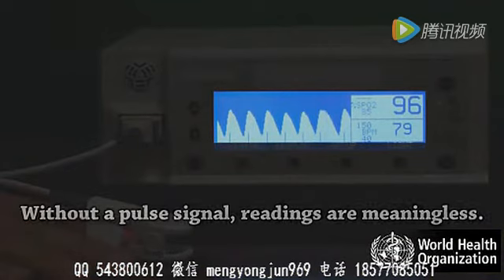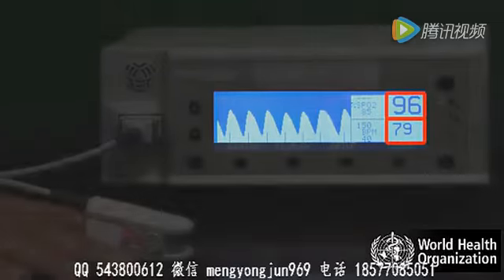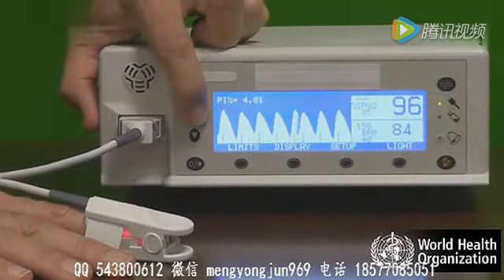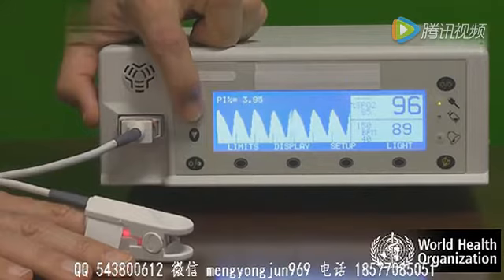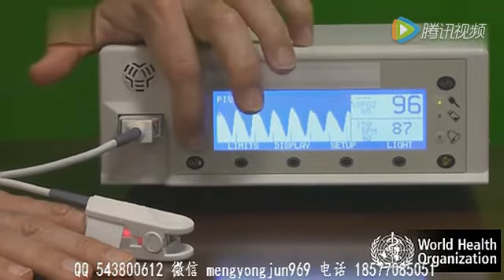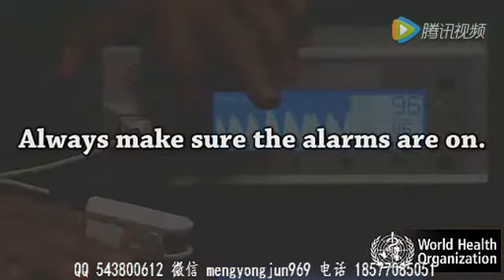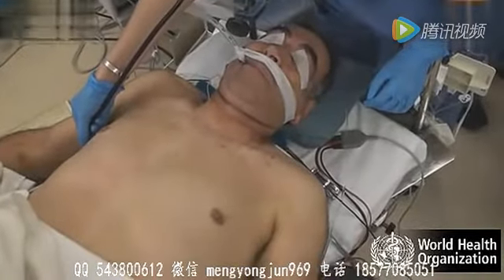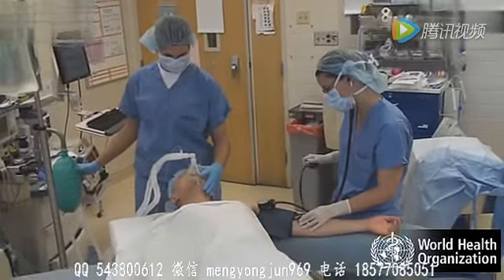Once the unit has detected a pulse, the oxygen saturation and pulse rate will be displayed. Adjust the volume of the audible pulse beep to a comfortable level. Never use on silent. Always make sure the alarms are on. Like all machines, oximeters may occasionally give a false reading. If in doubt, rely on your clinical judgment rather than the machine.